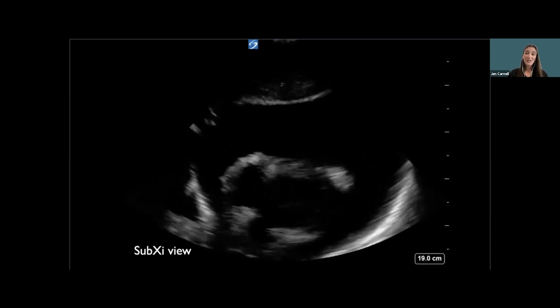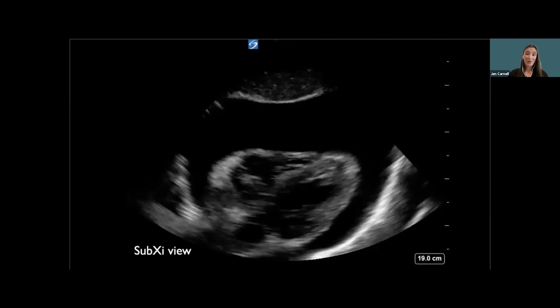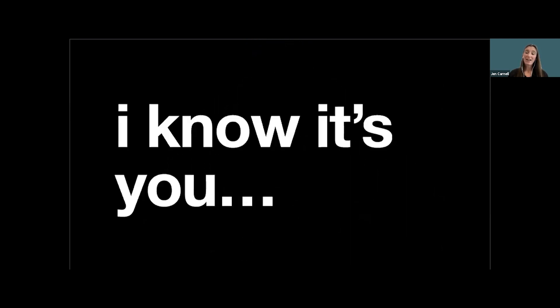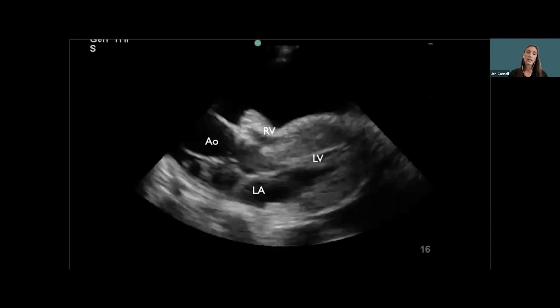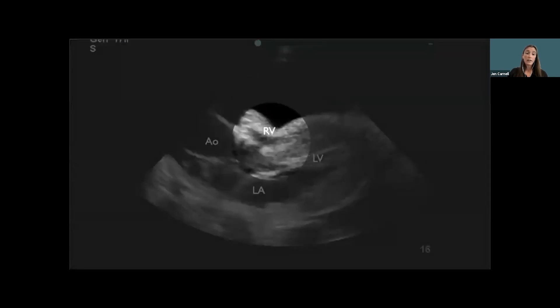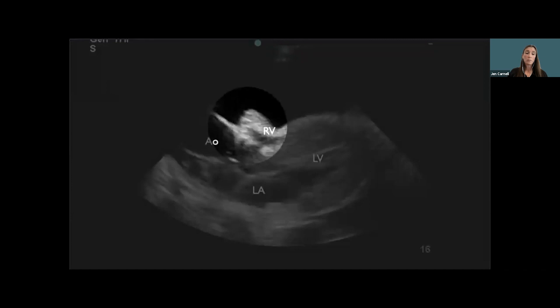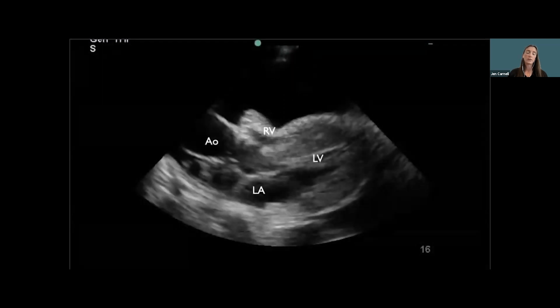I was scanning with one of the residents — our jaws hit the ground. This guy has a pericardial effusion from a bad case of pericarditis causing a massive pericardial effusion, and that's why he passed out. When I see pericardial fluid, I always want to know: is there tamponade? The hallmark of tamponade is RV diastolic collapse, and that's what we see here — a very obvious view of this right ventricle scalloping inward and collapsing under all of this fluid. This is a parasternal long view of the heart.